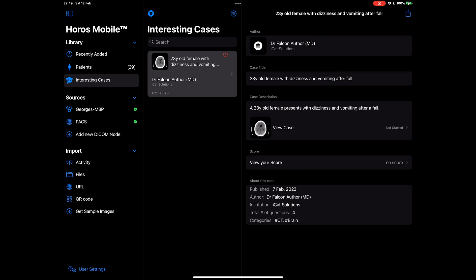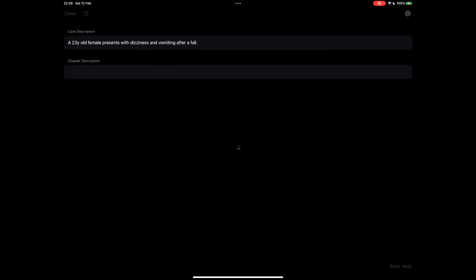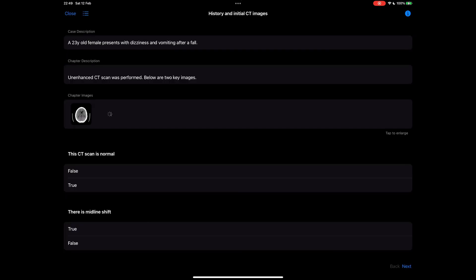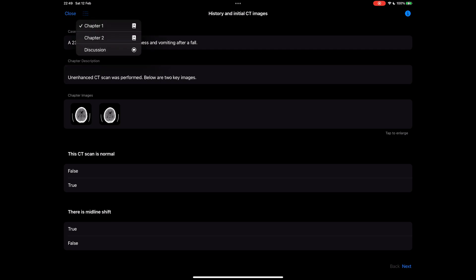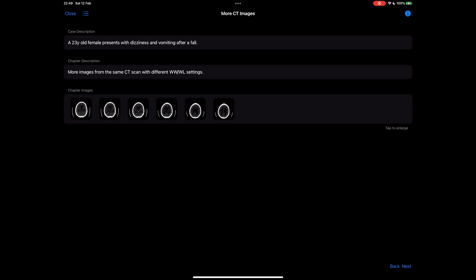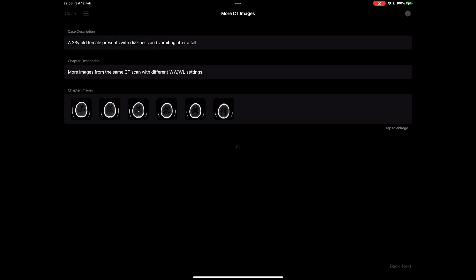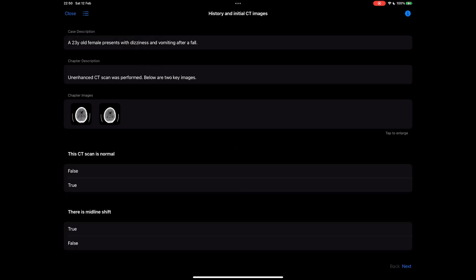I can view the case's contents by tapping on the contents button. I can navigate to any chapter from here or by tapping the next or back buttons. Once I complete the case I can close this view and move to another case.